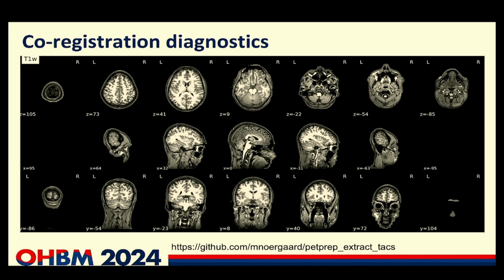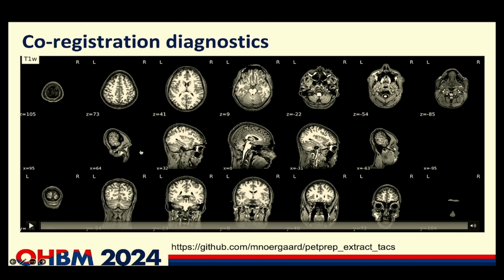Hi. Thanks. Actually, on this slide exactly, I think this is really great that we have co-registration diagnostics within the toolbox. The question I have is, is there a way to specify the cost function that you're using to co-register? Basically, if there's an issue with the co-registration, are we able to change it so we have a better realignment? Yeah, you can change the cost function.